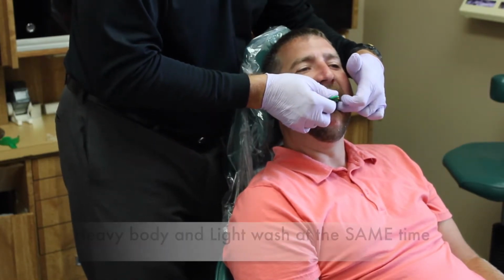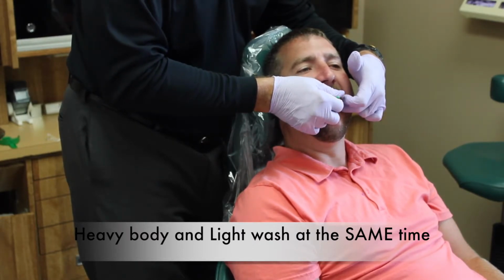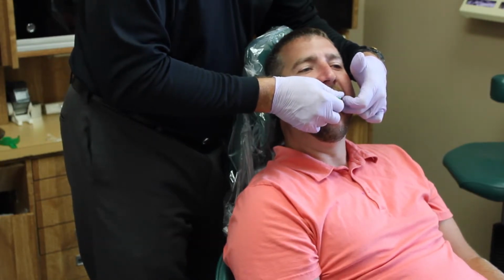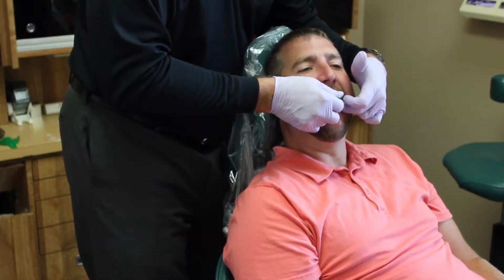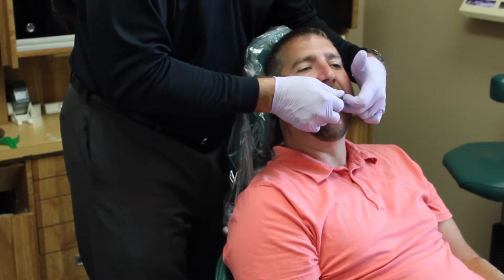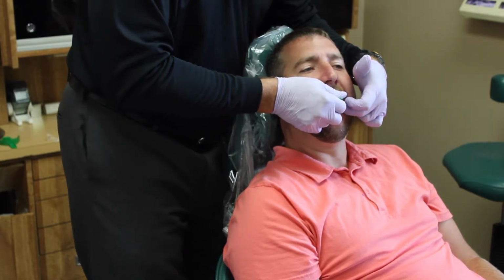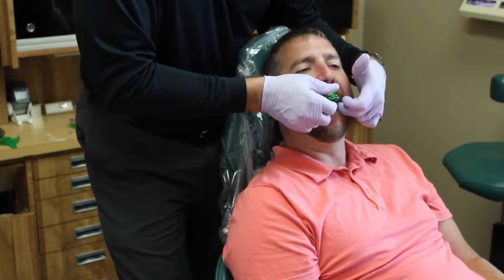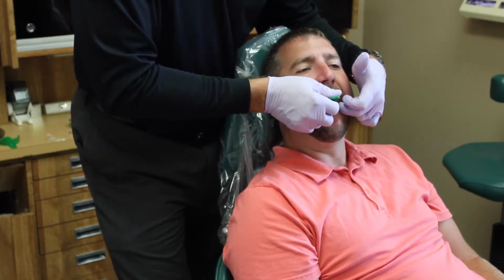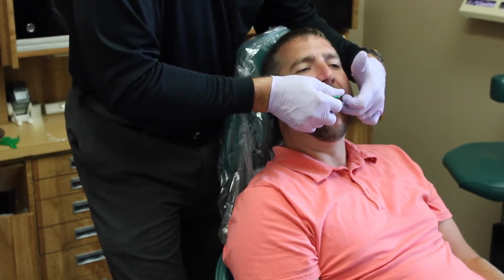So now I'm using a heavy body to carry and compress the light body into position at the same time. This is probably the technique I would have gone to first and foremost, just like I would be doing for crown and bridge, except I'd be using the light body over and around the preparation sites, and then using the heavy body in the tray to drive that light body into all the detailed areas. That works really nicely for a quadrant, maybe even a full arch impression where you've only got a few prepared teeth. The reason it works so nicely is because you've isolated those areas, you've dried them, you've put the material directly on them.